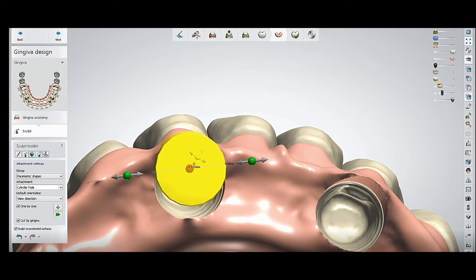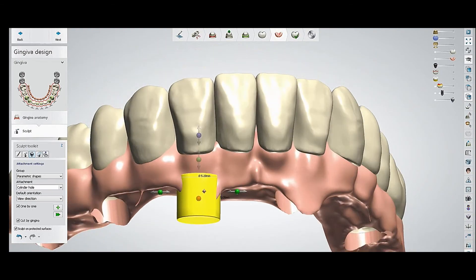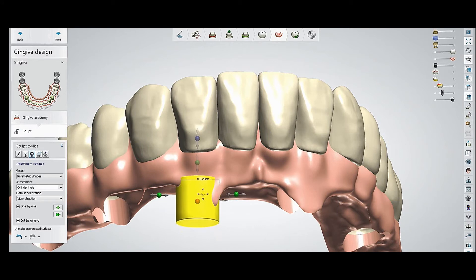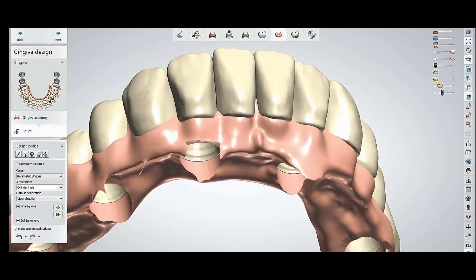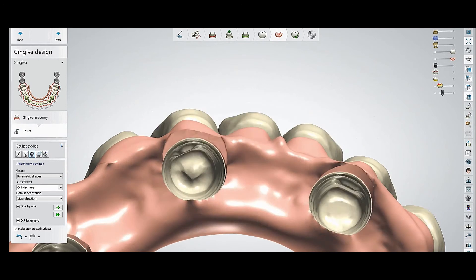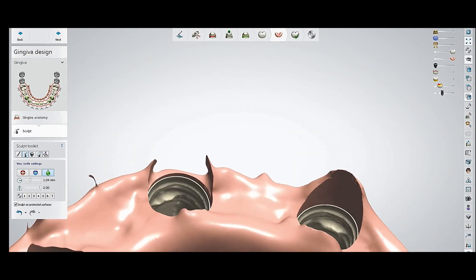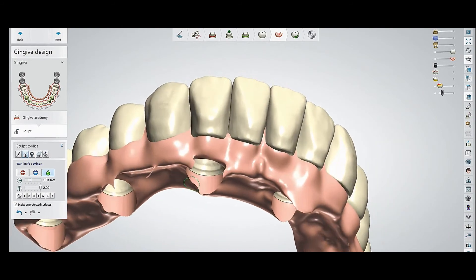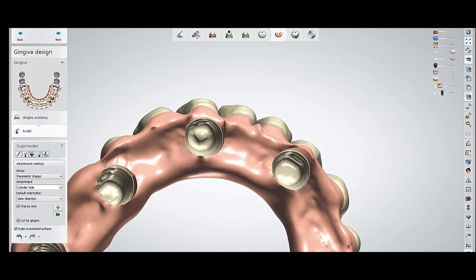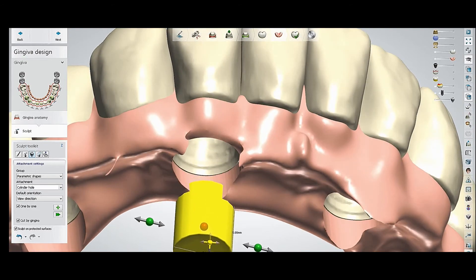You can change the width and the length as you want, so according to the area you can place it. Change the width of the attachment, place it where you want to cut, and just apply it. You can see the extra surface has gone and the area you want free from the gingiva is clear. Then you can smooth it. Whichever area you want to sculpt, just put the attachment, change the width and length, and cut.